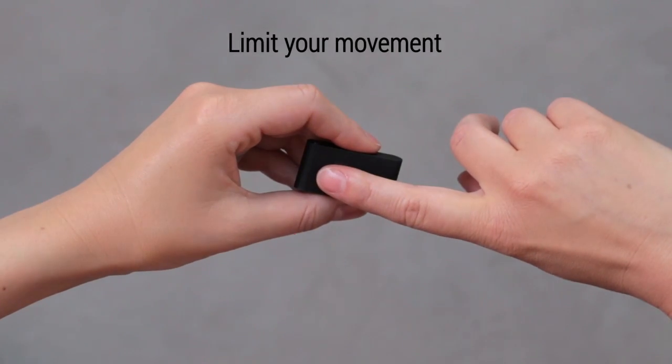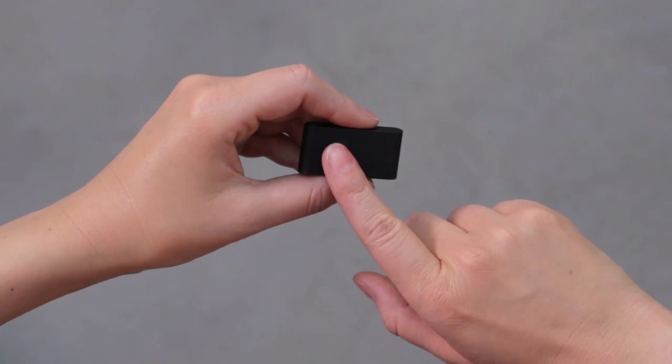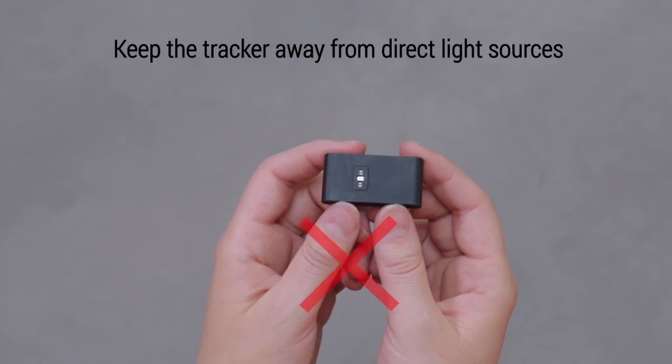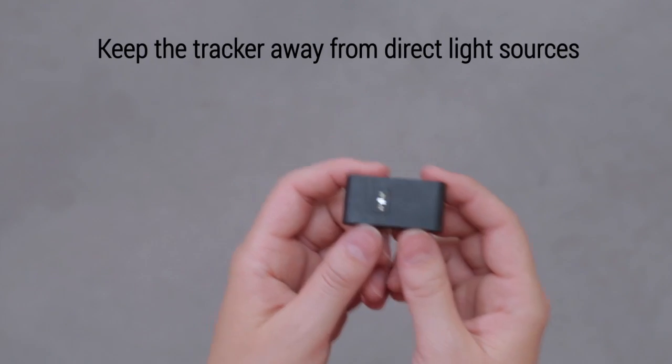While checking your vital signs, remain calm and try not to talk, as movements could prevent the reading or make it inaccurate. Make sure the Pulse OX isn't in a direct light source, as it could interfere with the photodiode.